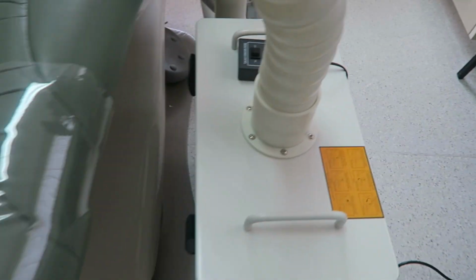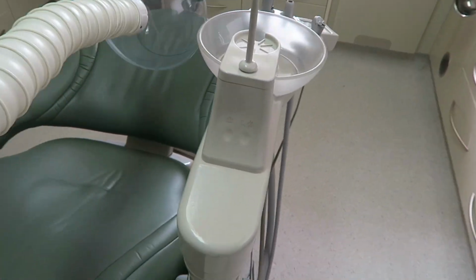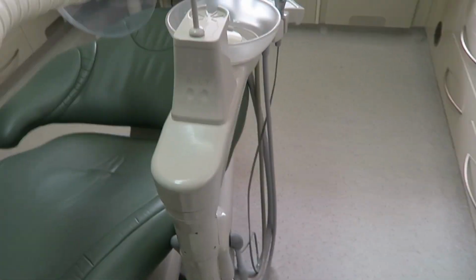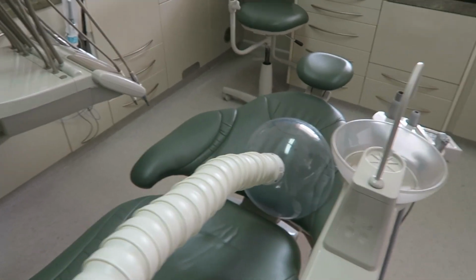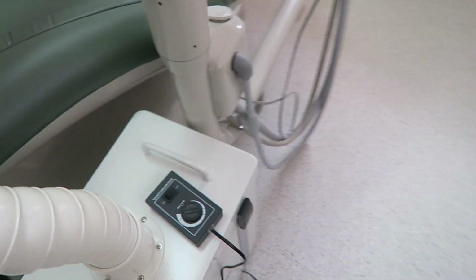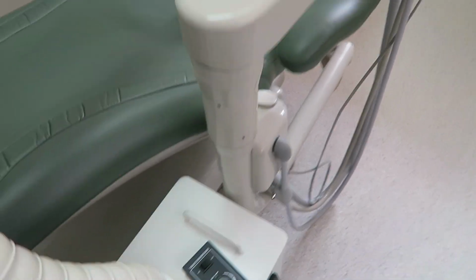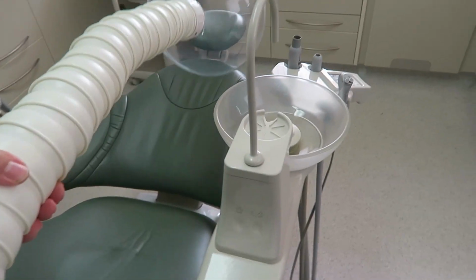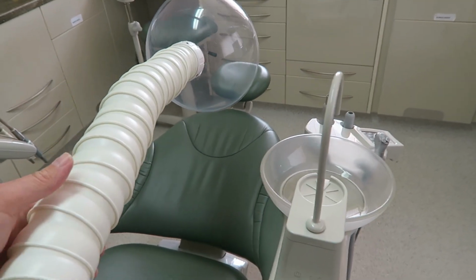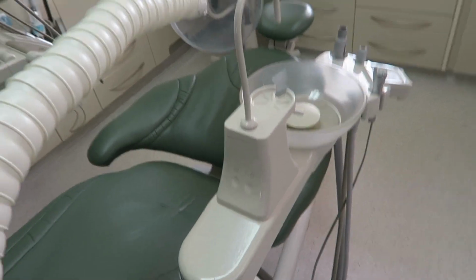The issue with this is I've got a little bit of a base down here, and to get that forwards like so and tuck that in a little closer, then the pipe doesn't quite reach. So I've got this issue with the floppiness. I can bring that forwards and make that as close as possible here. Of course, that comes out like that, and then trying to get that to stay up.